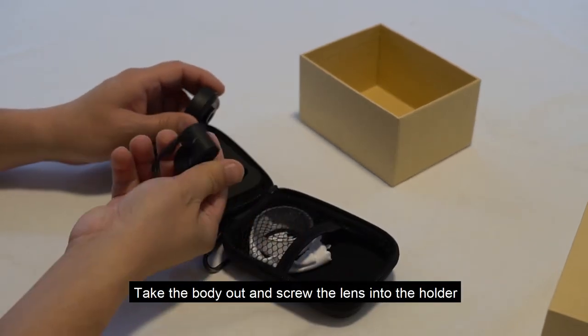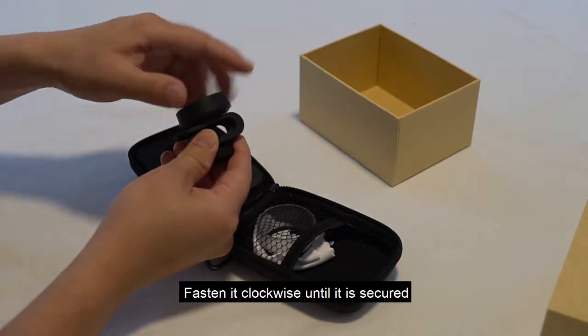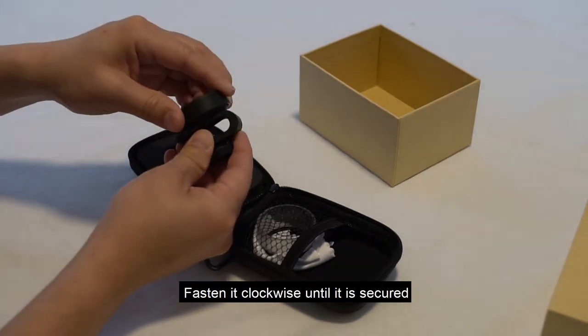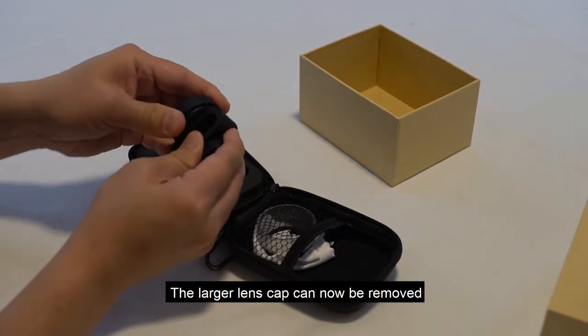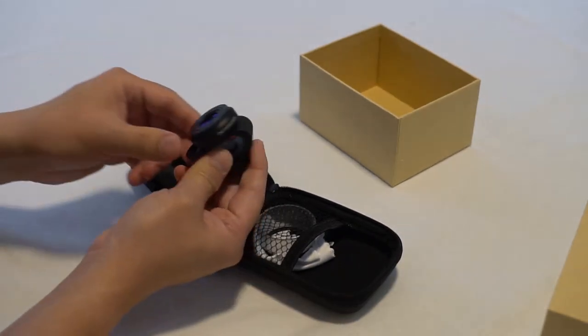Take the body out and screw the lens into the holder. Fasten it clockwise until it is secured. The larger lens cap can now be removed.